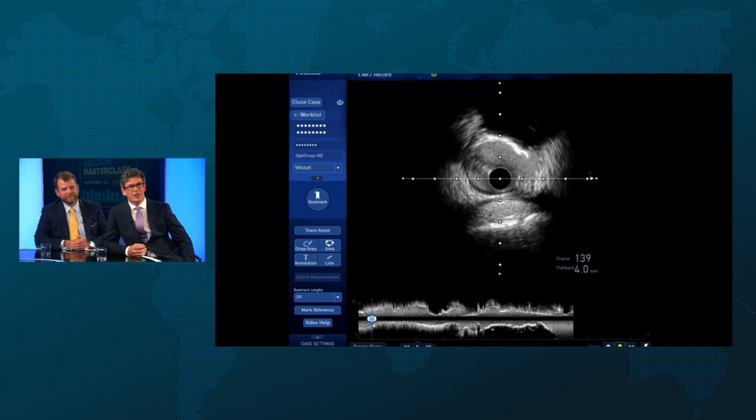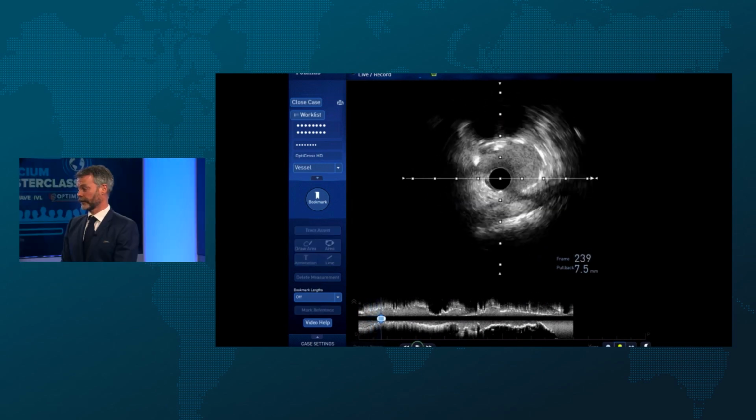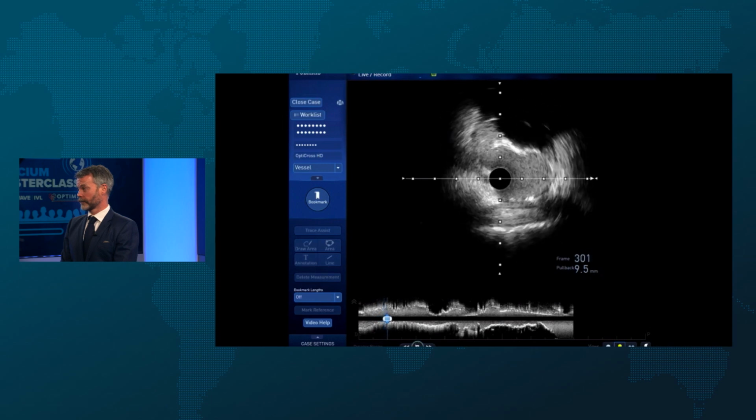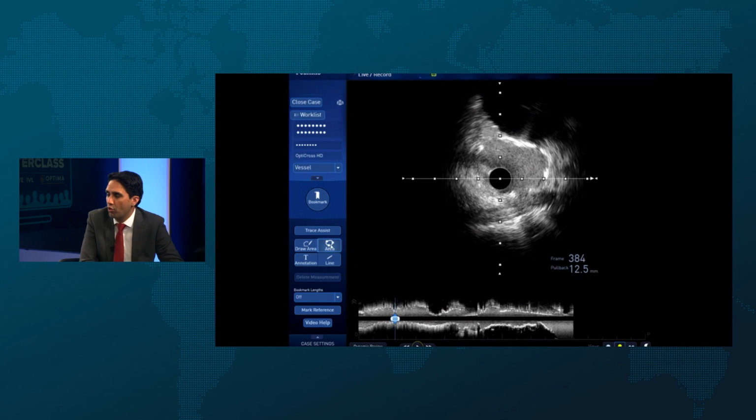The ledge is perfect there, isn't it? Yeah, it's nice. Happy with that? Definitely. That's a classic. So you've got the deformed nodule, the nodule's deformed, and that's the key. You can see it as a big circle on top there. We're going to talk about that a little bit later on, the deformability and the eccentricity.